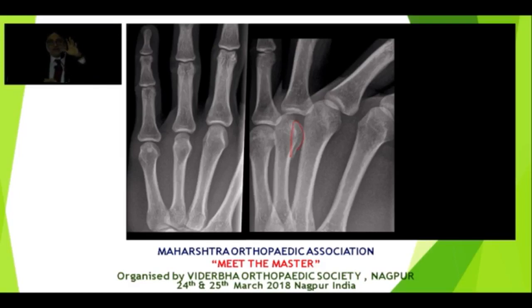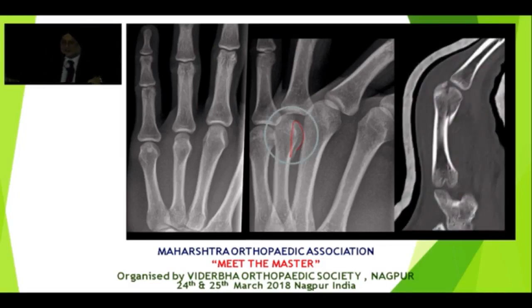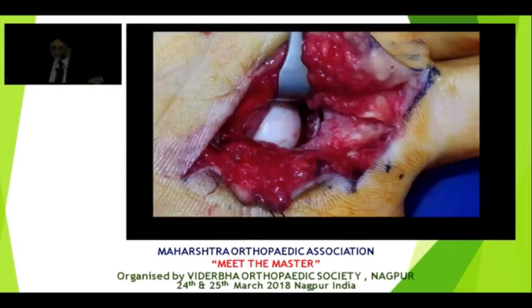And what happens with these fractures is, if you do a dorsal approach, you can't see the fragment because it's on the far side. Again, CT scan helps to explain, number one, where the fragment is. Number two, I know now the dorsal cortex is intact, so I can do lag screws. If the dorsal cortex was broken, then I would do a dorsal approach because I would work through the fracture. Because the dorsal cortex is intact, I have to go on a volar approach, right? So CT scan is really useful to plan your fixation and to plan your approach.